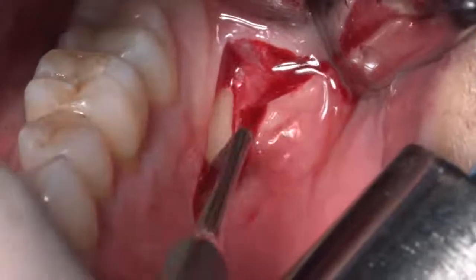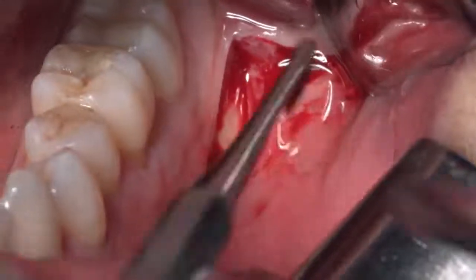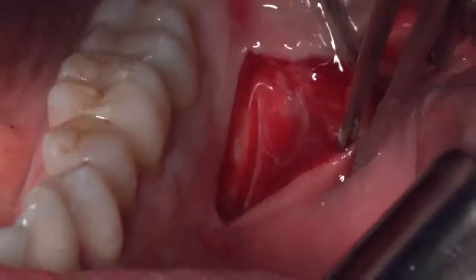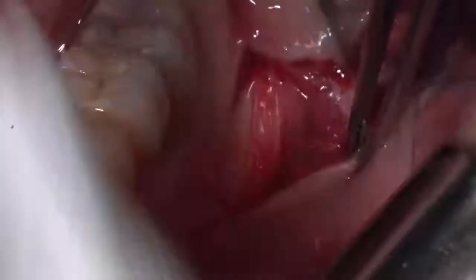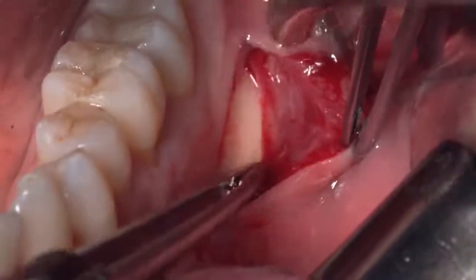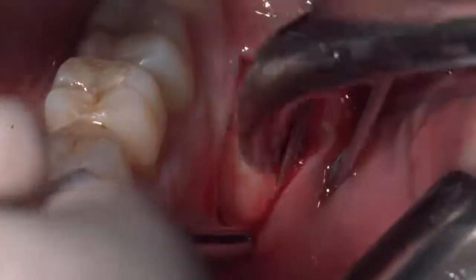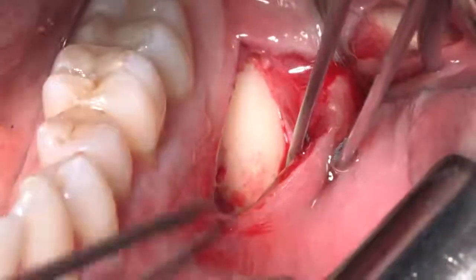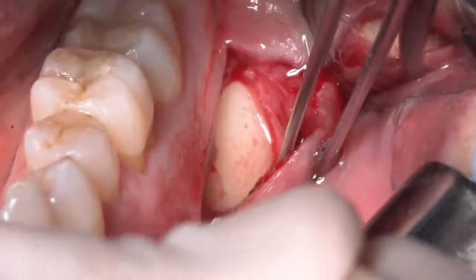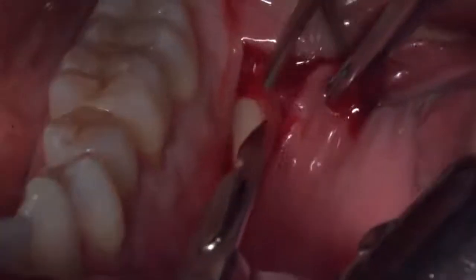In this case there is very little bleeding. You don't have to cut the muscles because inside the muscles passes the buccal nerve, which comes from the lingual side and goes toward the chin, passing inside the buccinator muscle and piercing it. So you risk damaging and injuring this nerve.